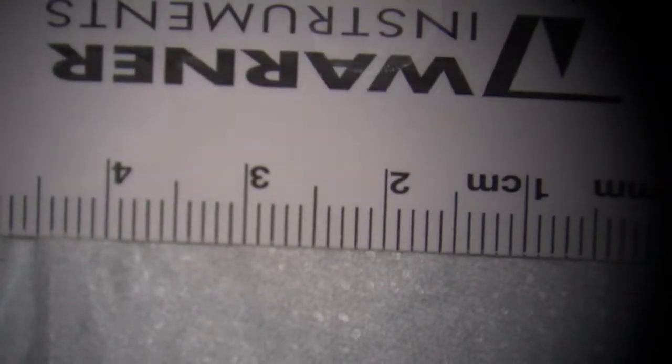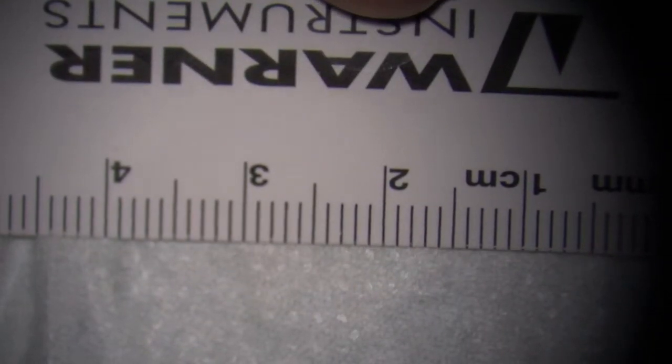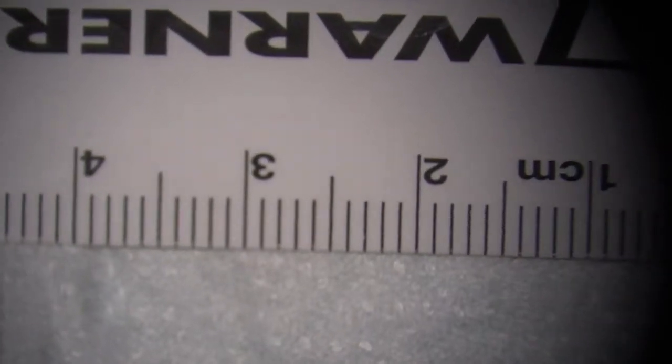Okay, let's zoom in the microscope all the way. How high does this zoom go? 2.4. Okay, now take a look at the field, maybe 2 centimeters in there. Go back to the zoom. I forgot the depth of field.